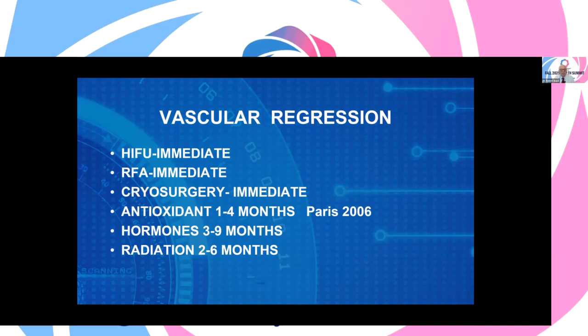Yes. Do they cure? Maybe, but at least we have a way of following the progress. So if it's going from a lot of vascularity to less vessels in a tumor, you're at least making progress. So if it's going from one vessel to this many, stop the treatment. Stop what you're doing. Try something else. Next slide, please.